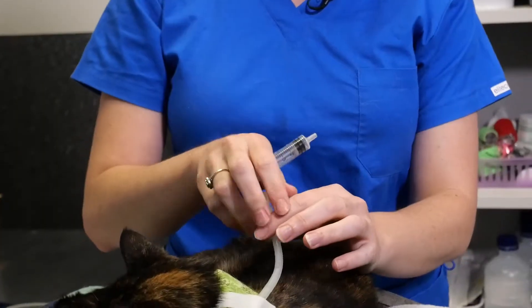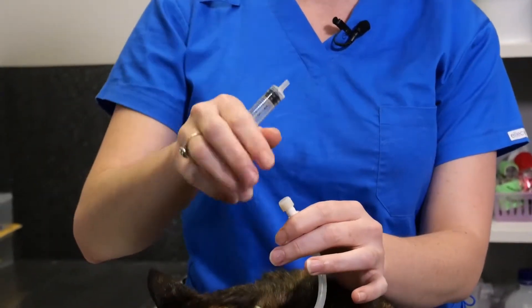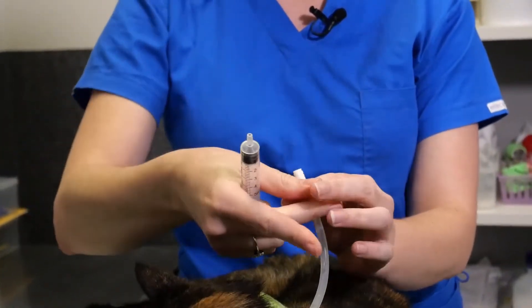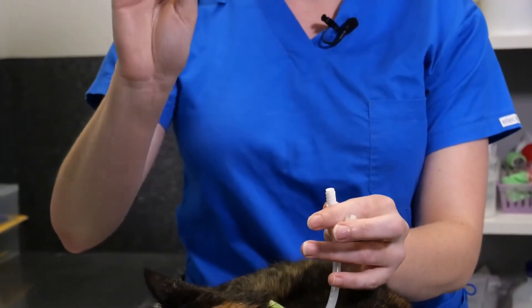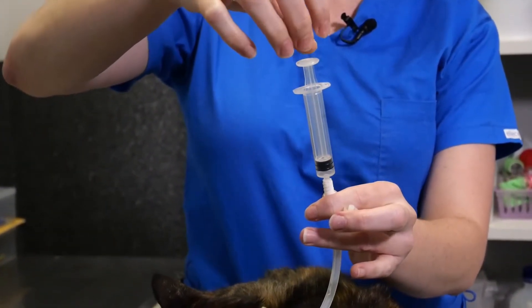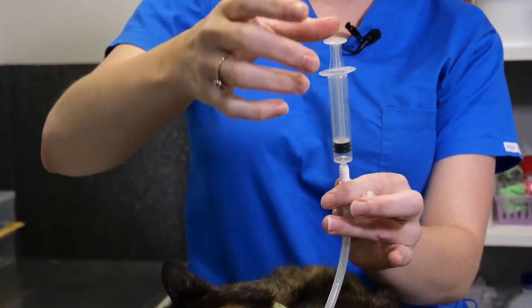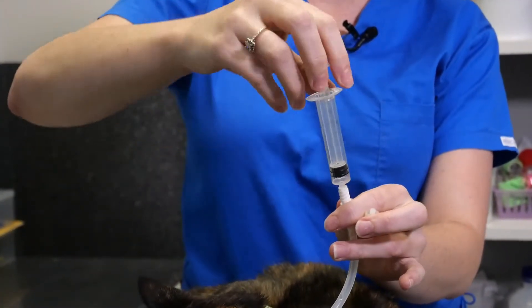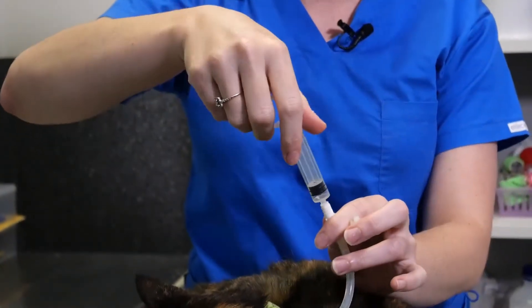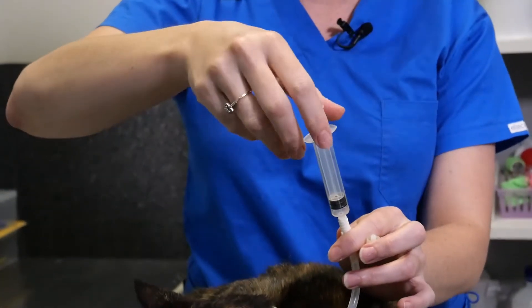Before we tube feed, you want to check for negative pressure and residuals to make sure the tube placement is in the correct spot and hasn't moved. Take the cap off the O tube, attach an empty syringe, and draw back. This is how we check for negative pressure — the plunger should go back toward the bottom. If you keep getting air back, it could suggest the positioning has moved and you shouldn't continue with the tube feed.